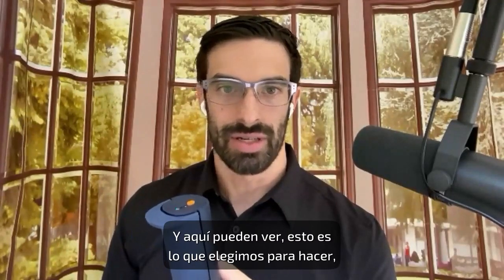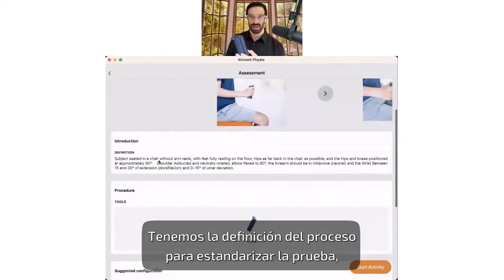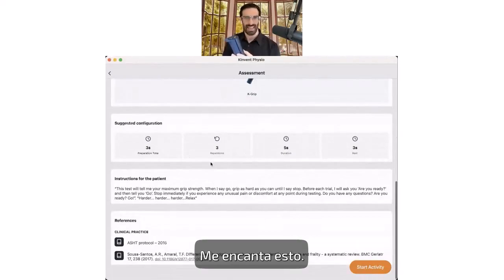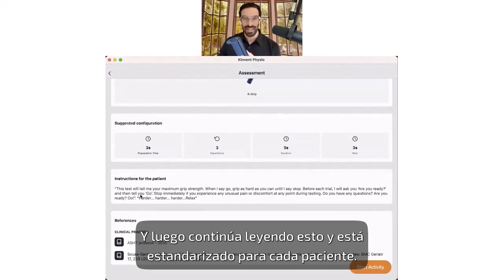And so here you could see this is what we're choosing to do, grip assessment. We have the definition of the process to standardize the test. We have the tool utilized. This is a suggested configuration. And then I love this. These are the instructions for the patients. This test will tell me your maximum grip strength when I say go, and then you continue reading this, and it's standardized for every single patient.